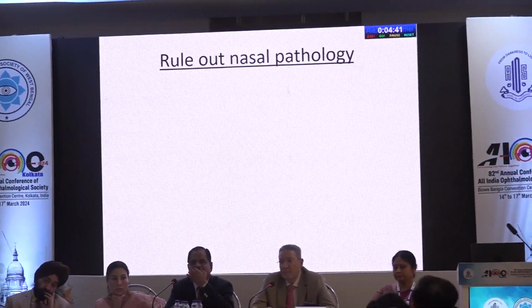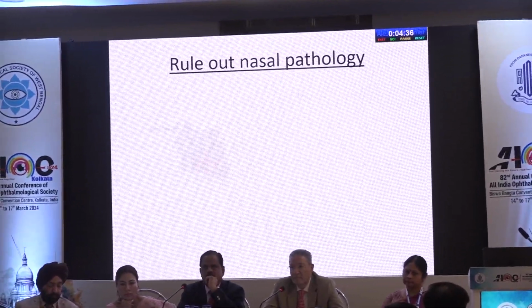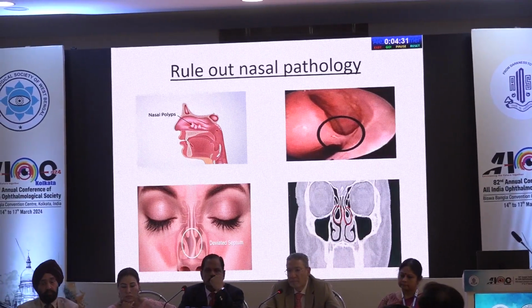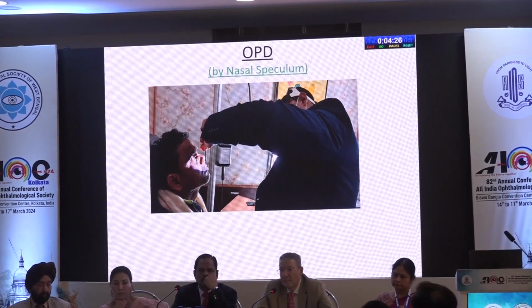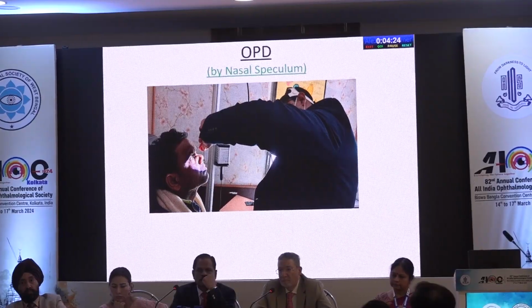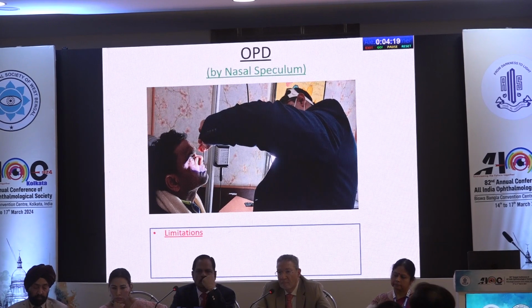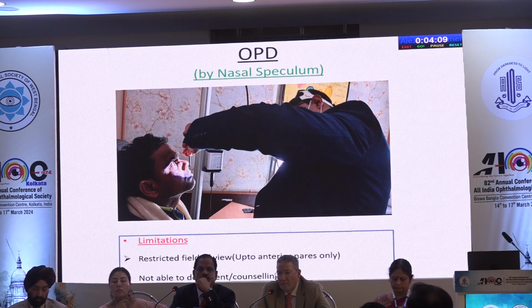So for successful management of any case of epiphora, we have to rule out nasal pathology like nasal polyps, nasal synechia, DNS, or hypertrophied middle turbinate. To rule this out, traditionally we do nasal speculum examination in the OPD. But the limitation is the restricted field of view. We can only examine up to the anterior nares, and we are not able to document it for counseling the patient. We can't save the pictures or show them to the patient and attendants.